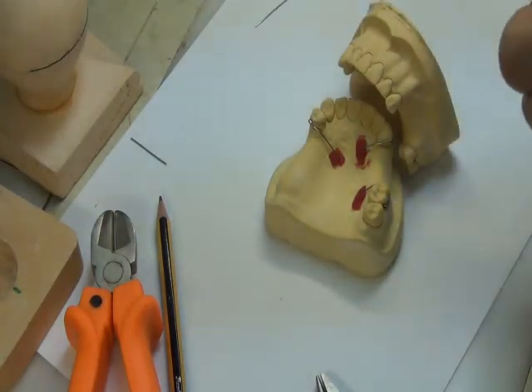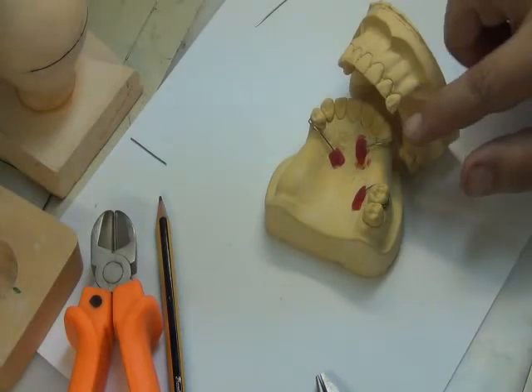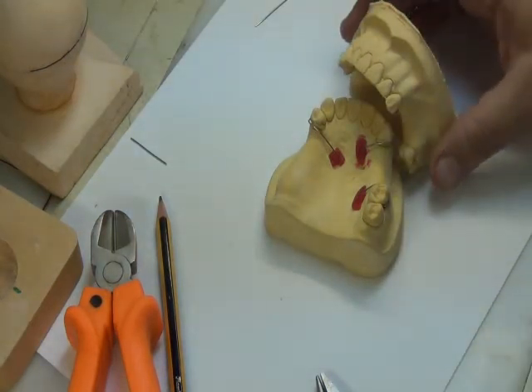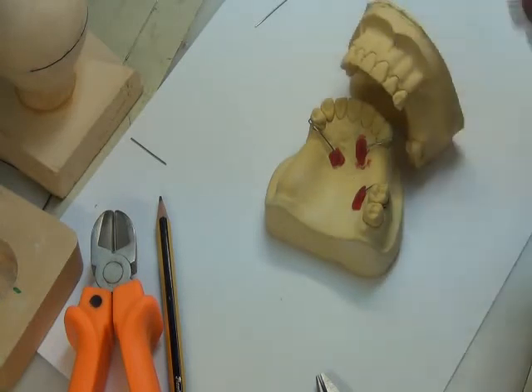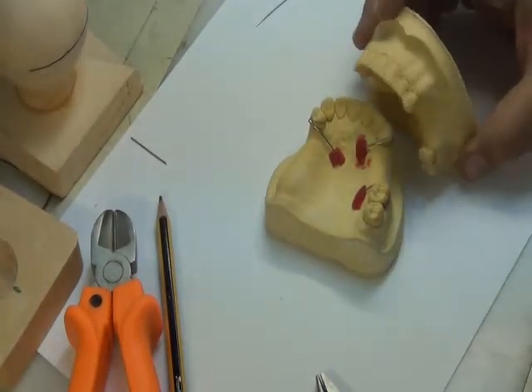So we selected the material. We said it's acrylic for temporary RPDs. We selected the shade. We take it from inside the patient's mouth using a shade guide. And with the shade guide, we put the tooth exactly in its place. For example, if I'm looking for a premolar shade, I have to put the shade guide with the tab of the tooth in the correct location, because if I put it here, it will appear lighter. If I put it inside the cheek, in the dark area of the mouth, it will appear a bit darker. So when we compare teeth with natural teeth, we should put the tooth tab exactly in the place where the missing tooth is. Okay? So this is how we select the shade.